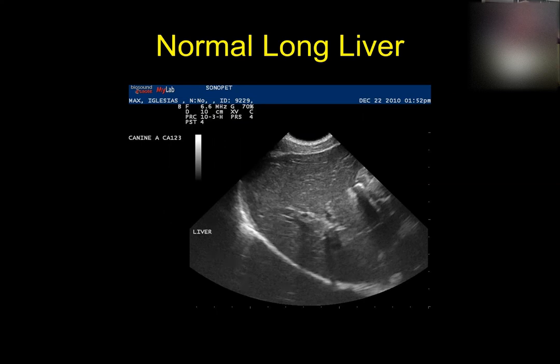Which way do you do the standard orientation of how you hang it? Okay, and then we talked about in veterinary medicine, you always hang lateral view radiographs with the head to the left. We typically don't put the head to the right when we hang those x-rays or look at those x-rays on a monitor. So typically it's always head to the left.